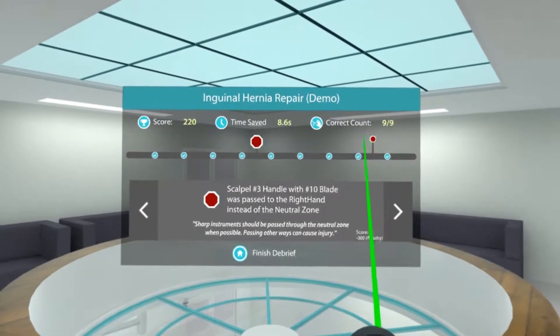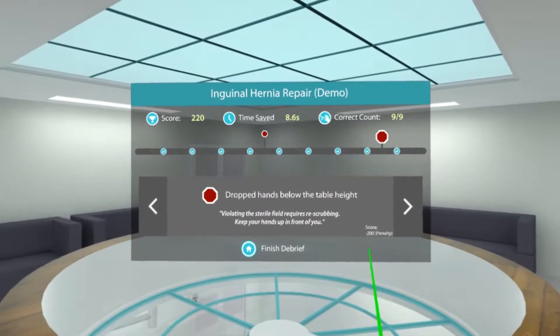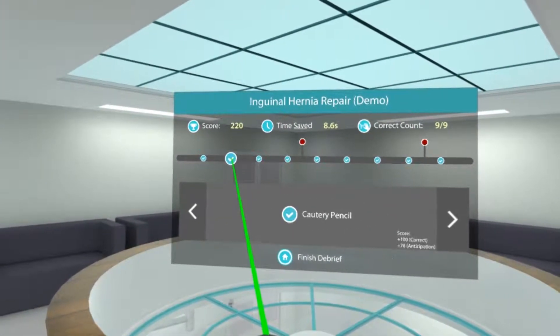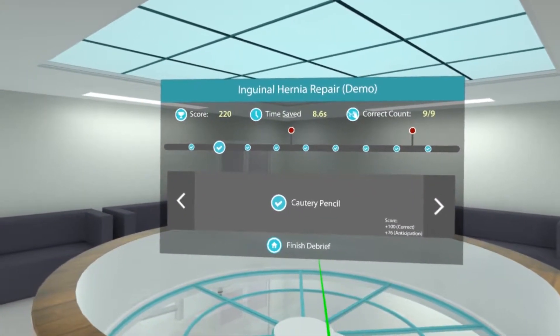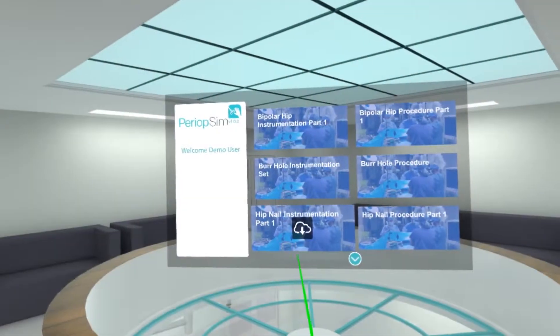I dropped an instrument as well, so you get penalized here too. And you'll notice that I saved some time — there were a couple of times where I anticipated, so I was rewarded for that as well. To complete this, you finish the debrief and then you'll go back into the lobby. Thank you for the time today.